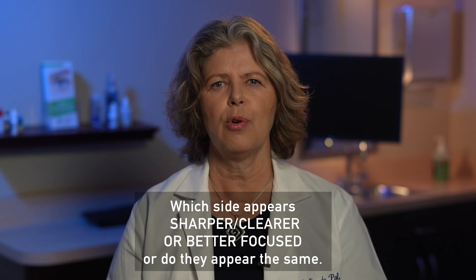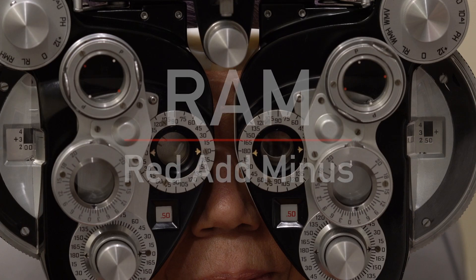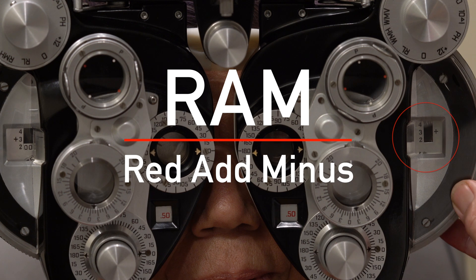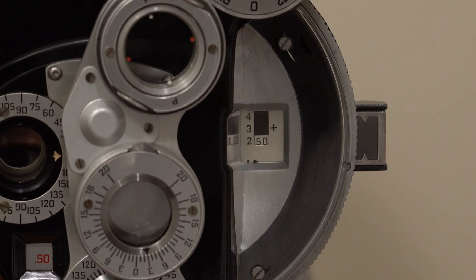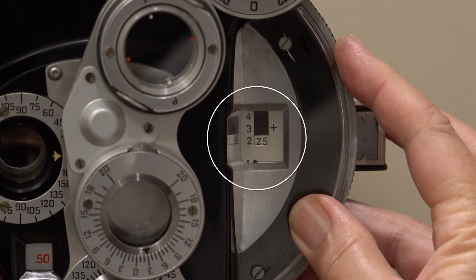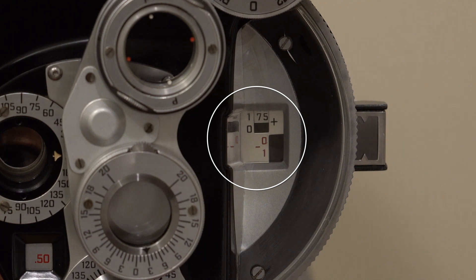You'll start by asking the patient which side appears sharper, clearer, or better focused, or do they appear the same? Do not ask which side is better, darker, or brighter. Two acronyms commonly used to remember this are RAM — red, add minus — in other words, if the red side is clearer, add minus lenses — and GAP — green, add plus — if green is clearer, add plus lenses. If the patient says red are clearer or both appear equal, add minus quarter diopter sphere. Continue this until the patient reports equal clarity between sides or until the green side appears clearer.